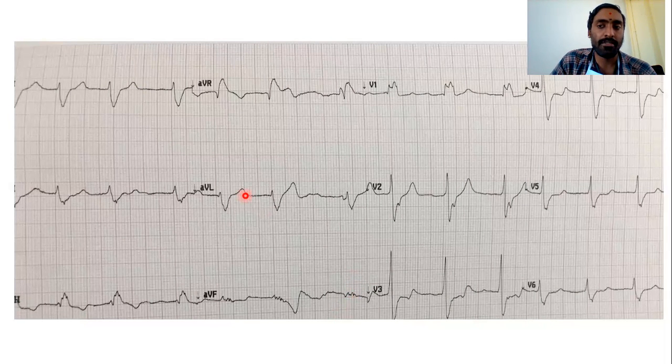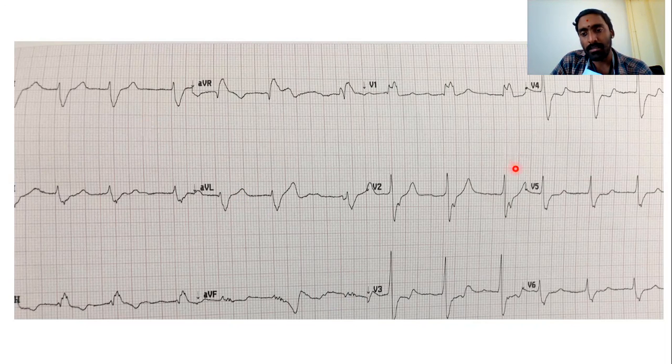So it is an extreme axis deviation. Once we have an extreme axis, apart from that, we look at the chamber enlargements, which will be discussed subsequently. Then we look at QRST changes.